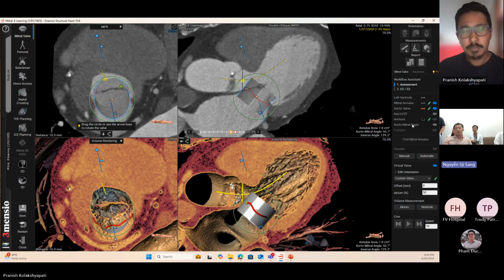So how much obstruction is acceptable? Oh, I'm not sure about that. Probably have to ask clinicians.